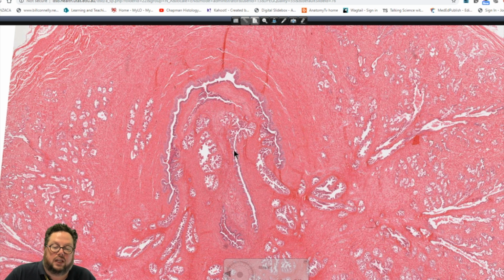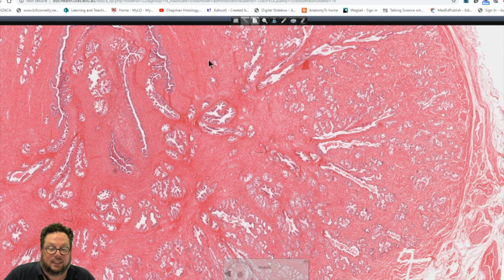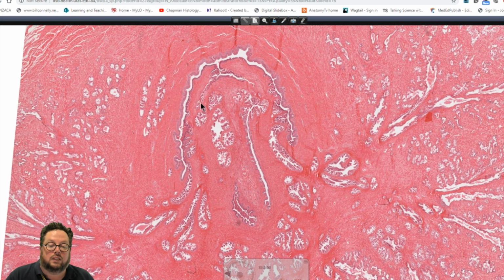Right, so then you can see the glandular components of the prostate gland here. We have what we call mucosal glands, submucosal glands, and then the main prostatic glands out here. Now this is leading a little bit into the male reproductive system, or sorry, the reproductive system of people identified as male at birth. And so the prostatic urethra is here. At this point, you can see the top of the upside down U. This is known as the urethral crest. And then these spaces, these sides here, are known as the urethral sinuses.